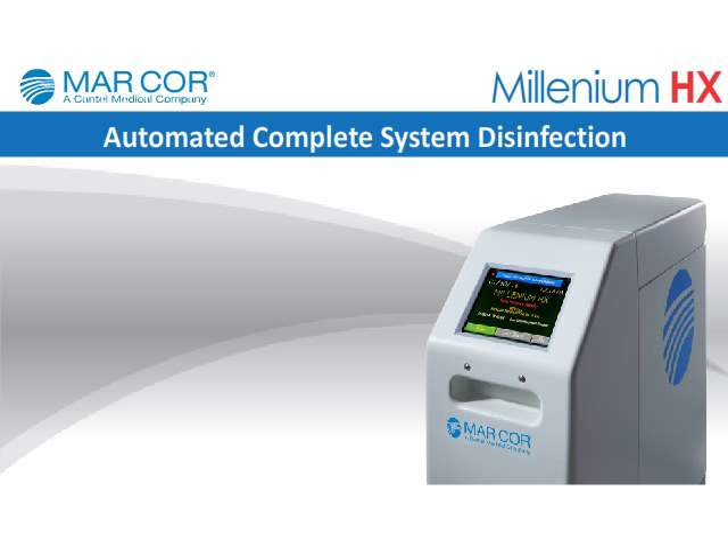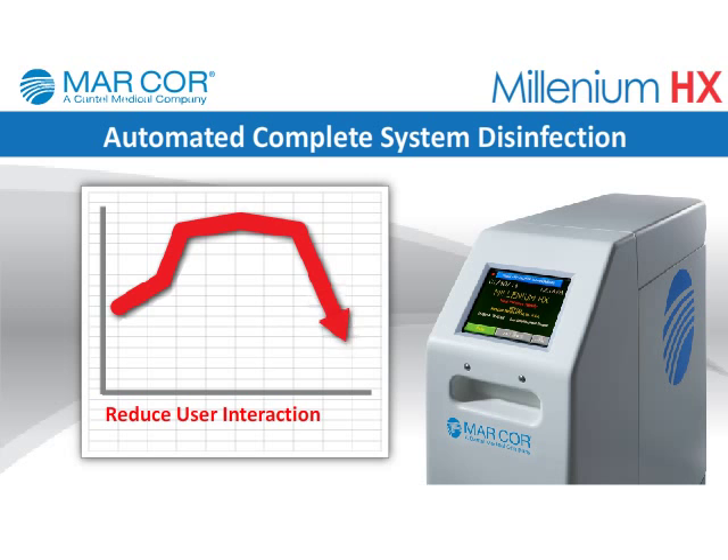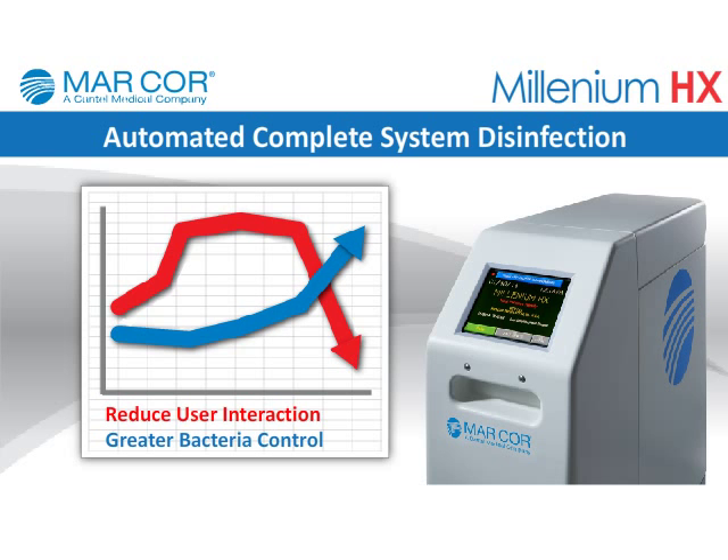Automated complete system disinfection: Simple keystrokes permit ongoing heat disinfection cycles that reduce operator interfacing, create less chemical dependence and exposure, and help ensure greater bacteria control, protecting both patients and staff.